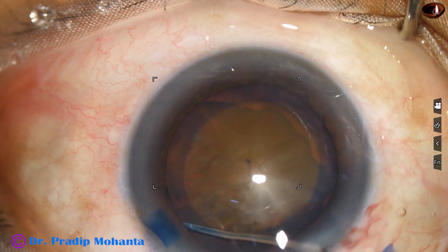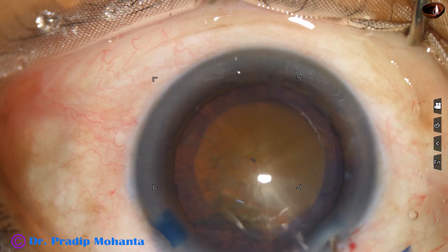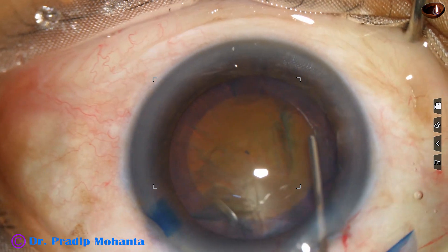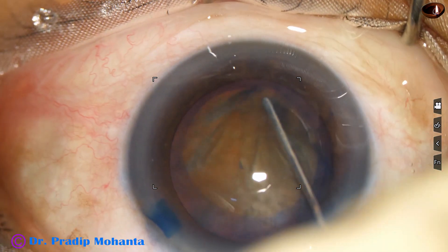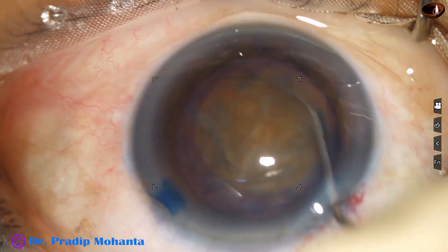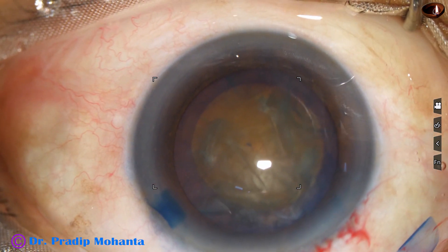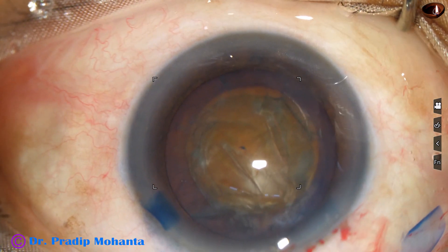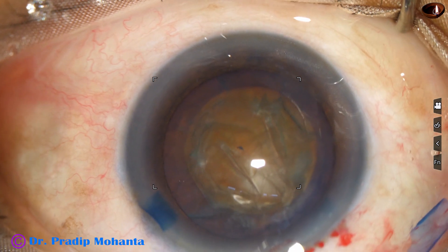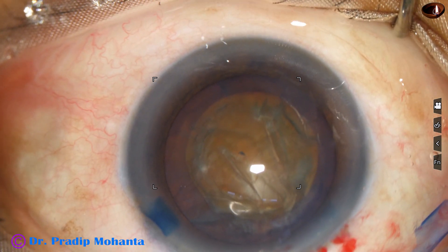Hydrodissection is done with small amounts of BSS at multiple points. We are having some red glow reflex. That is why the cataract is appearing softer — it is not appearing grade 5. But as we do the surgery, we will understand that it is really hard.